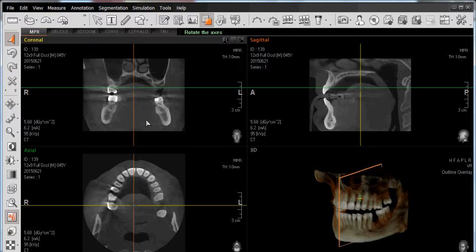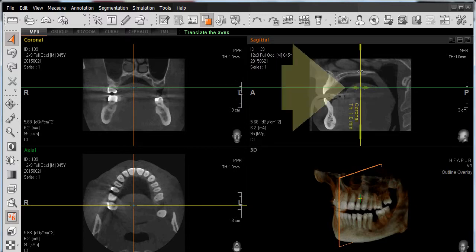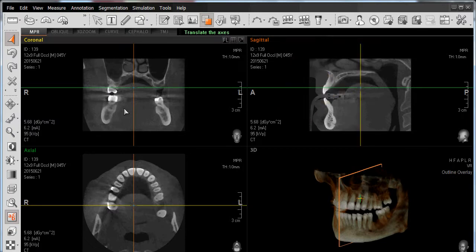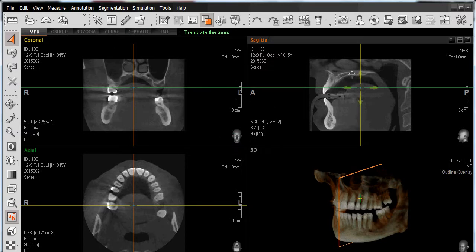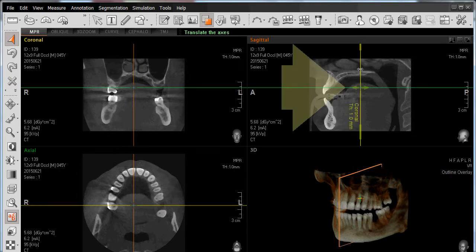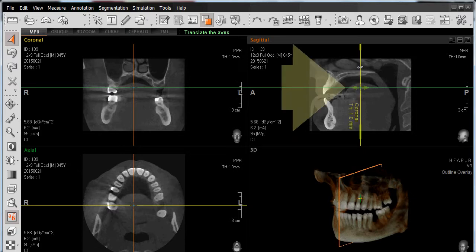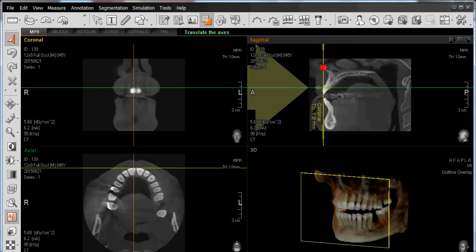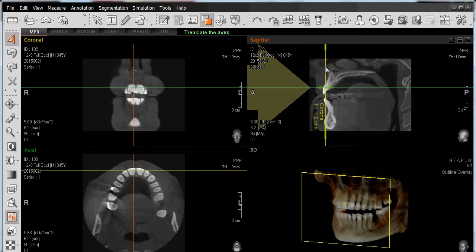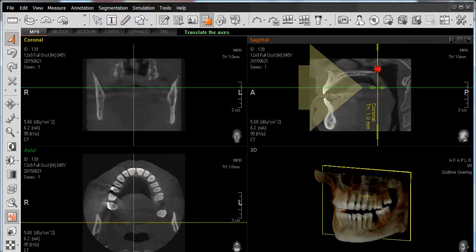In order to navigate through these grayscale views, we'll start with our coronal view. Simply hover the mouse on top of the yellow line, which identifies the coronal view, and note the large arrow projecting towards the coronal line. This identifies the aspect of our view as it relates to the coronal window, as shown by the patient orientation in an anterior-posterior aspect. By positioning the mouse on top of the line, the arrow changes from a triangle shape to a black arrow going in opposite directions. Simply left-click and drag to navigate anterior or posterior.